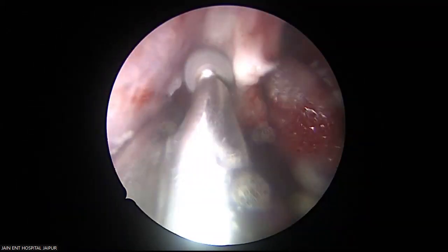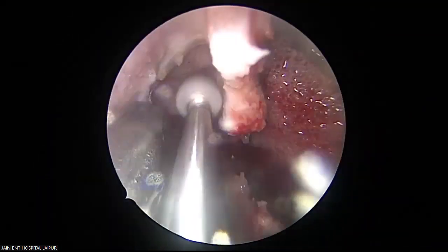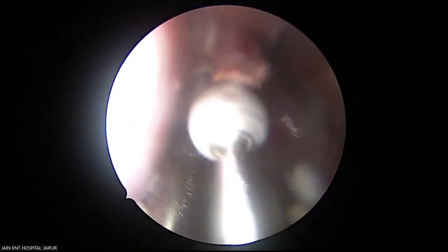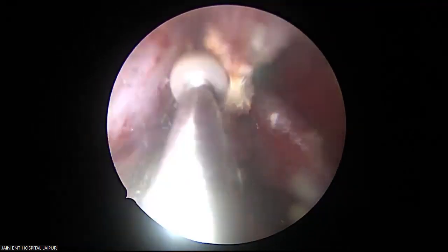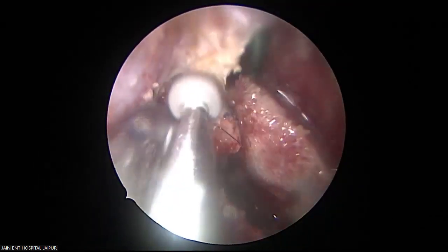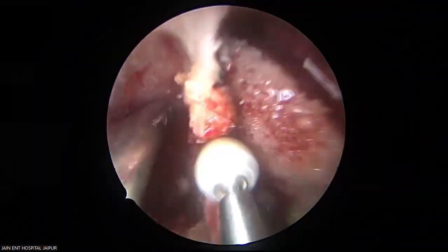See, I am flushing with the floor. So I cut my nasolacrimal duct sharp close to the floor. If I leave it hanging, it can get fibrosed. So I don't want to leave it overhanging. You have to flush right to the floor. That is the key to prevent epiphora. See how superiorly we need to go.